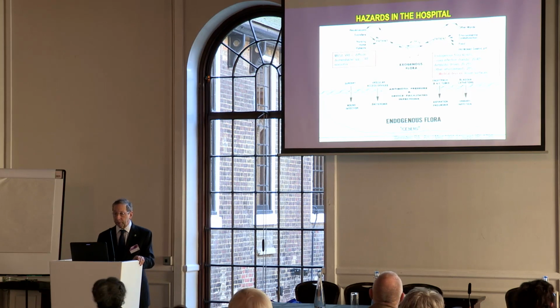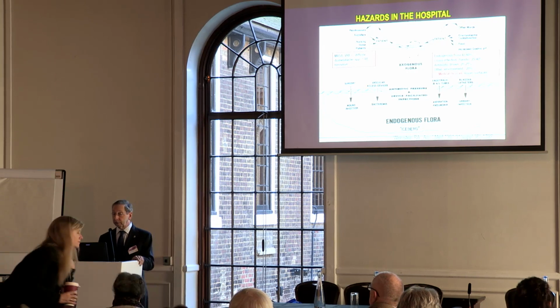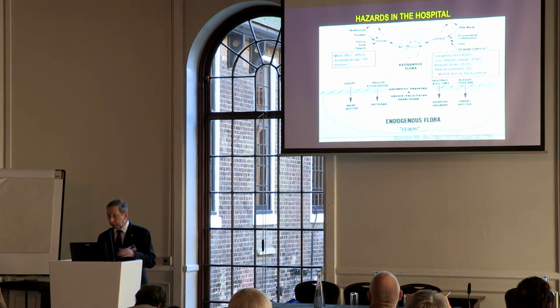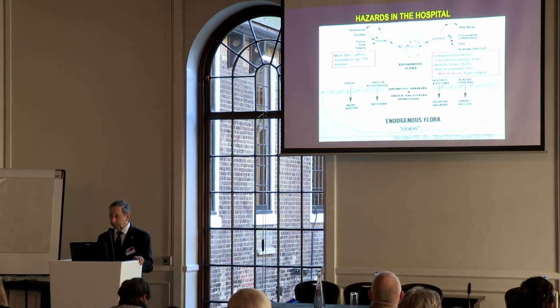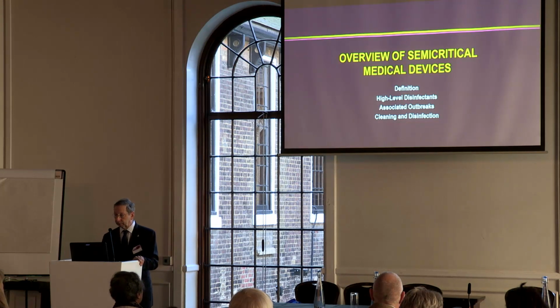We're particularly worried about MRSA, VRE, C. difficile, Acinetobacter. These days, carbapenem-resistant Enterobacteriaceae, norovirus. And he looked at the different types of infections that we see, and he estimated that about 20% of infections came from the other, which he, in the article, described as the environment, that really includes room surfaces and medical devices, and I'm focusing today on medical devices.